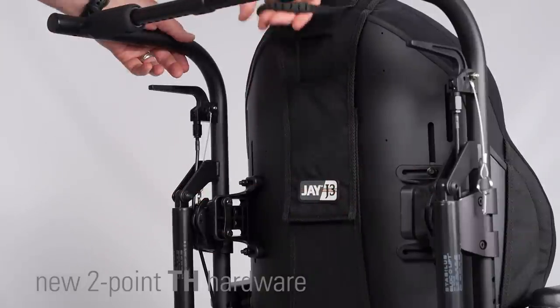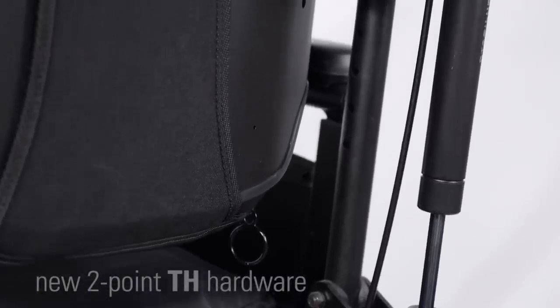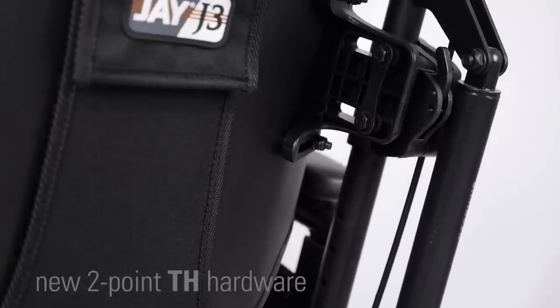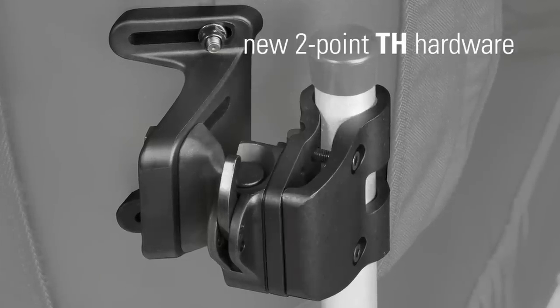making it easier to install, remove, and reattach the back, and reducing interference with other components. A perfect solution when navigating the mechanical obstacles often found on tilt-and-recline wheelchairs without sacrificing strength. The result: the new 2-point TH hardware.